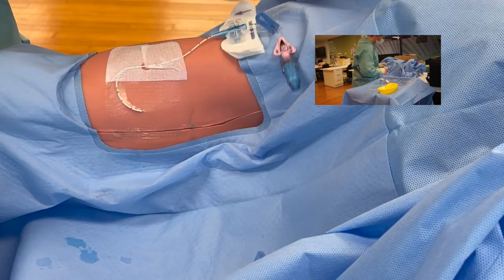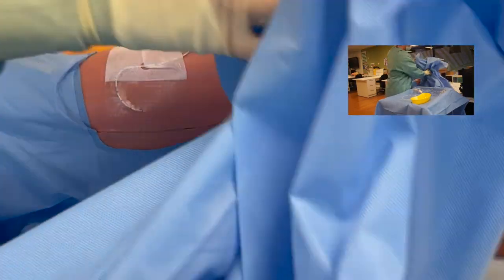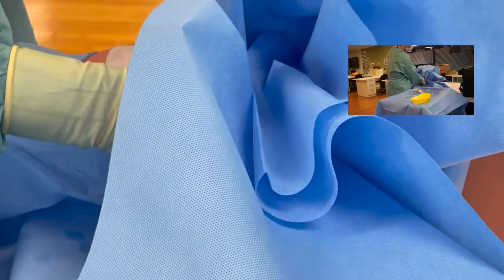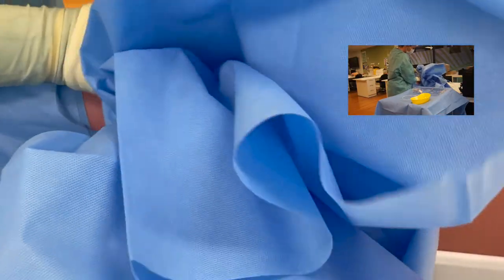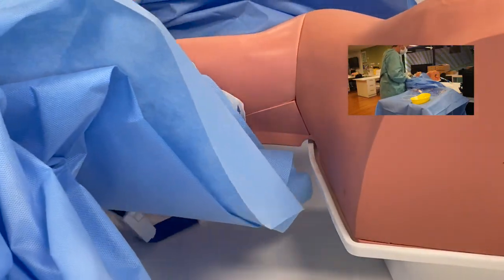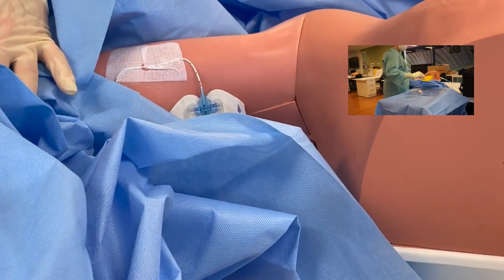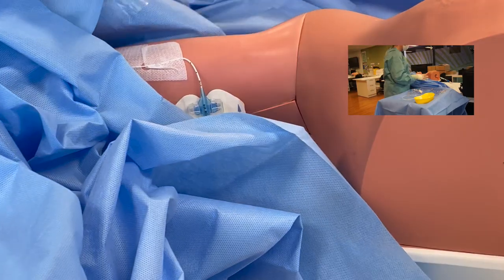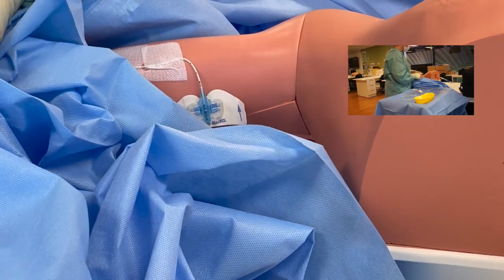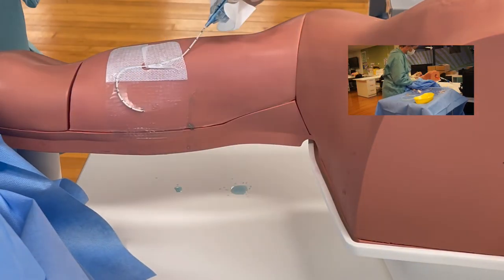It doesn't matter that there's a little bit of line exposed there - the insertion site is covered, the stat lock is heading in a cephalad direction, and you are safe to remove the drape off of the patient, warning them that pulling the adhesive drape off may be uncomfortable. You would dispose of your sharps in one motion into the sharps bin, which should be large enough to receive all of this. Discard the rest of your items into general waste, then doff your gown and gloves and perform hand hygiene. That is what your PICC line would look like for your patient.